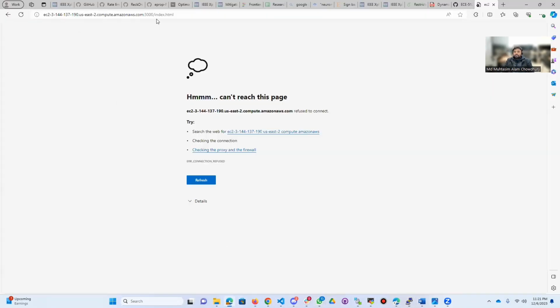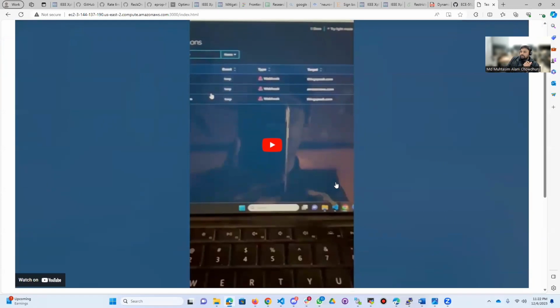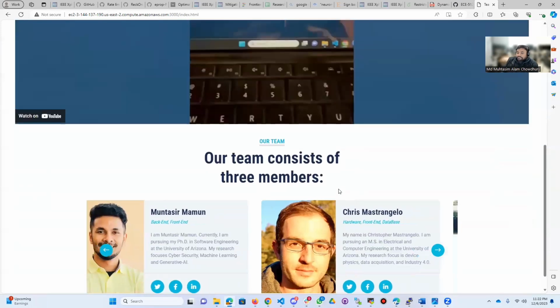Here is the link for index.html that will show the main page of our project. If you refresh it, we can see the main page here. As you can see, the name of our product is HeartSync Pro. That means it syncs with the heart rate and shows it with better quality, provides the data from patient to the physician, keeps the patient healthy, and we believe in living healthier.